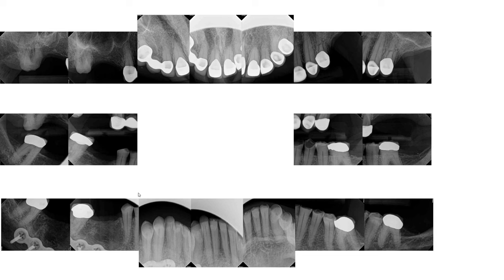This patient fell about three years ago, and she ended up getting extensive dental work done to restore the teeth in the anterior maxilla. If you spotted a horizontal fracture on this particular tooth, you'd be absolutely correct.